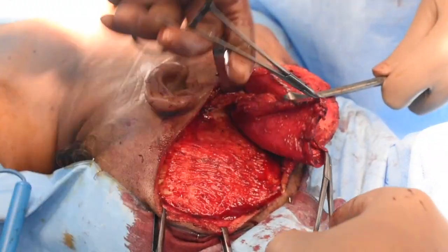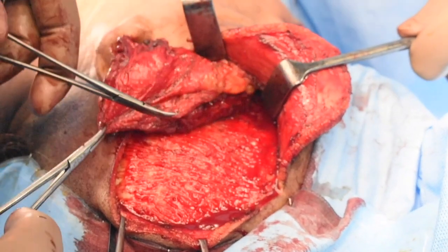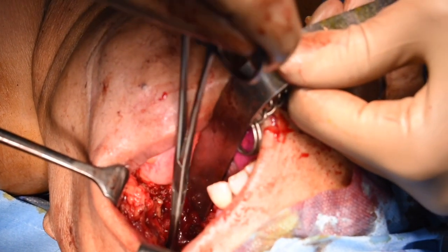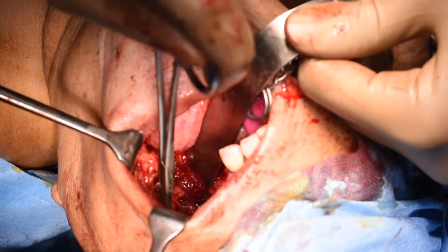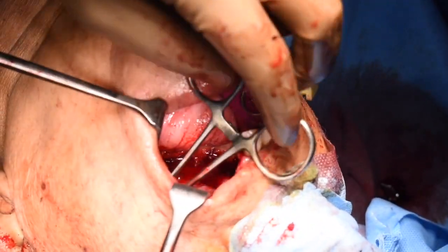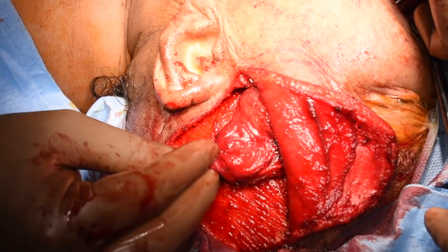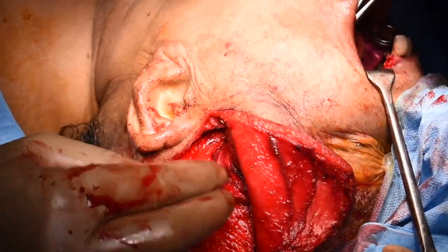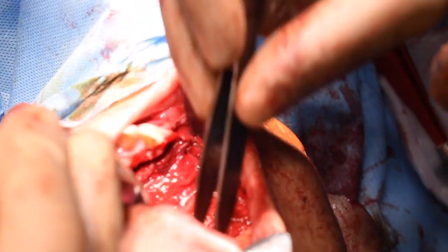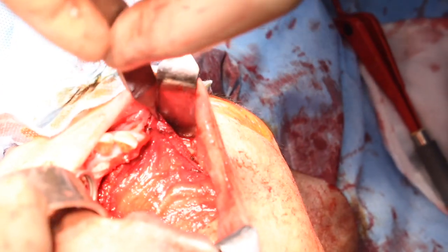Now it is ready to be transferred to the oral cavity, medial to the zygomatic arch. A Babcock is inserted medial to the zygomatic arch from the oral cavity to the donor site. The distal edge of the muscle is held using the Babcock forceps and gently pulled into the oral cavity. The flap is transferred to the oral cavity and insetting is done with 2-0 Vicryl.